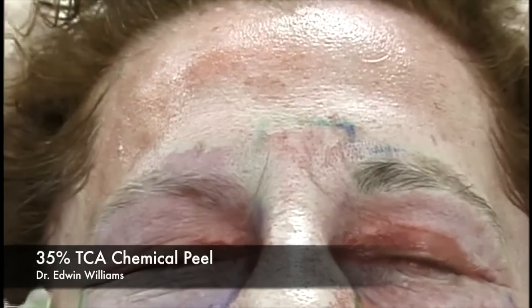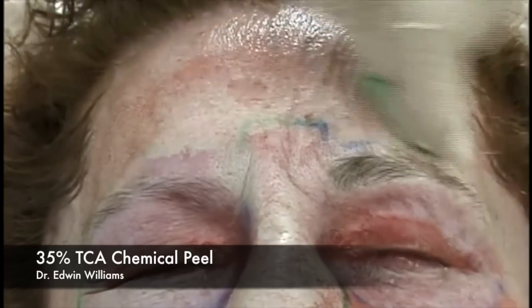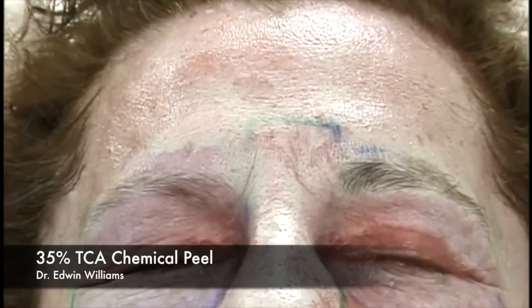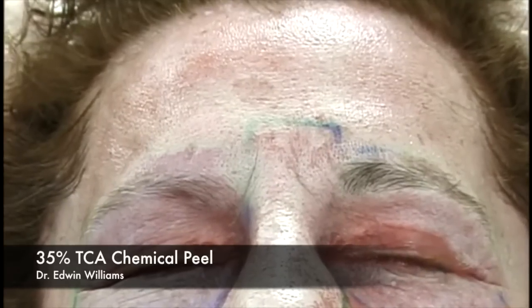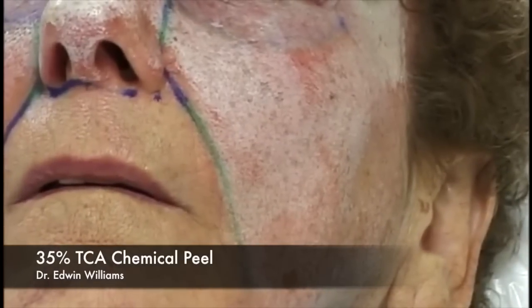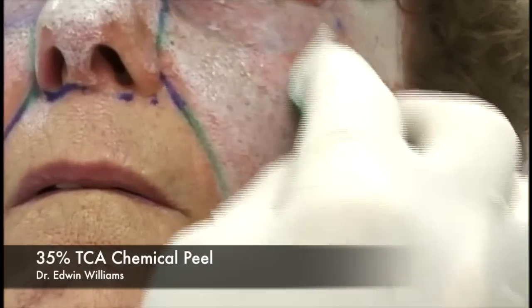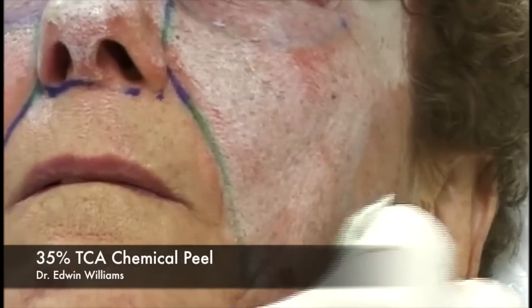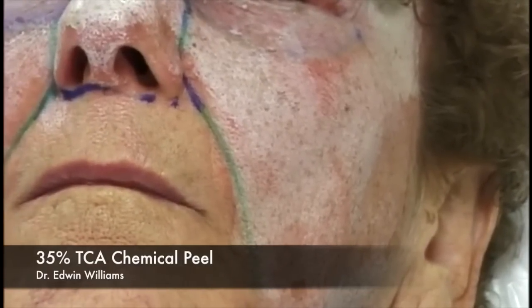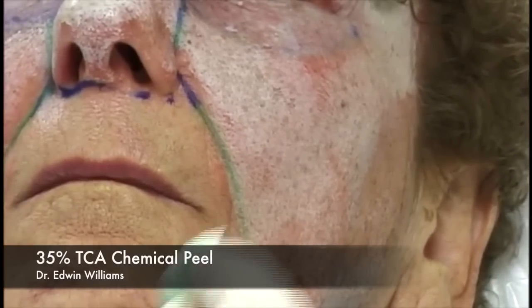Once we've reached maximum frosting on the forehead, we cool down or neutralize that area and continue on to the lower face and cheeks, looking for the same homogeneous white frost we saw on the upper face. It's important to go actually below the angle of the mandible—because of the shadowing effect, if you stop a little above the angle you can actually see the line of demarcation.